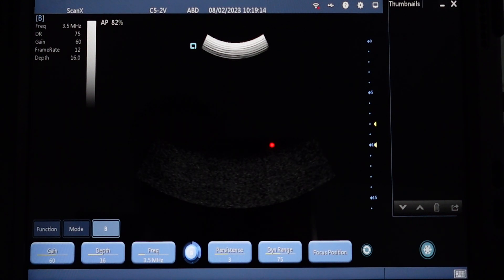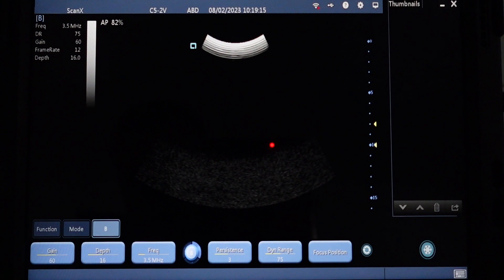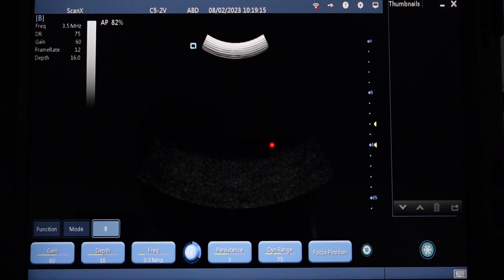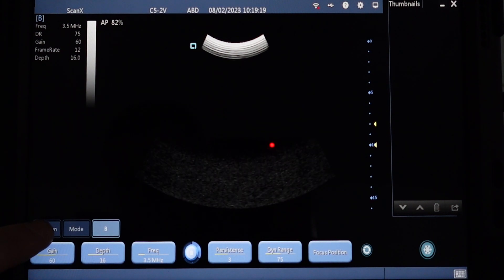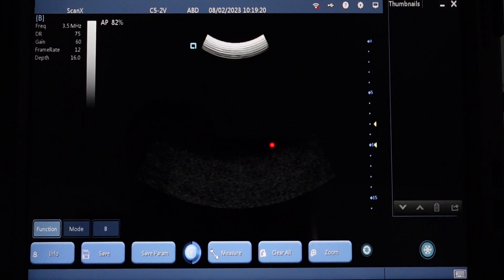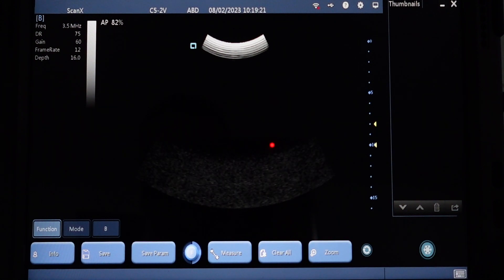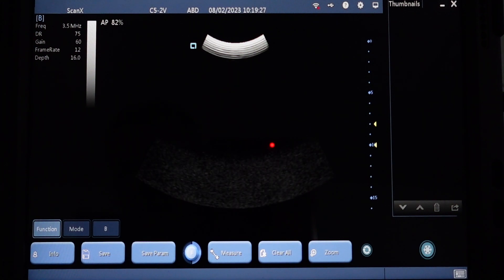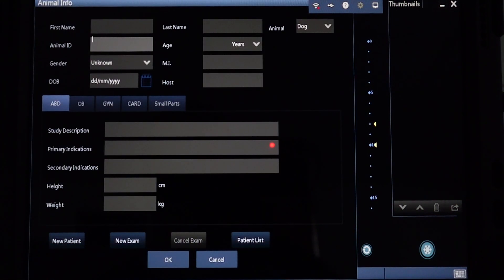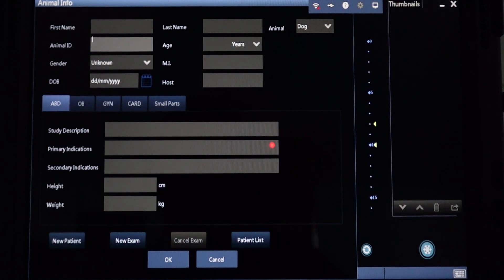Now, to input patient data, hit Function on the bottom left hand side of the screen. This will bring up a new menu at the bottom of the screen. On the far left hand side, hit Info. This will bring up your patient data screen.